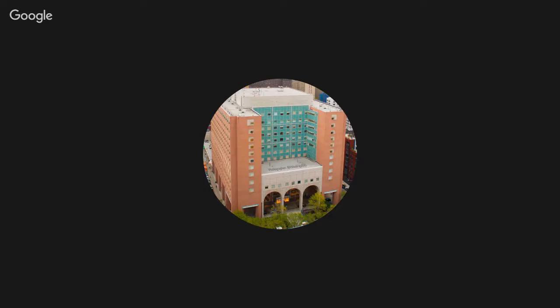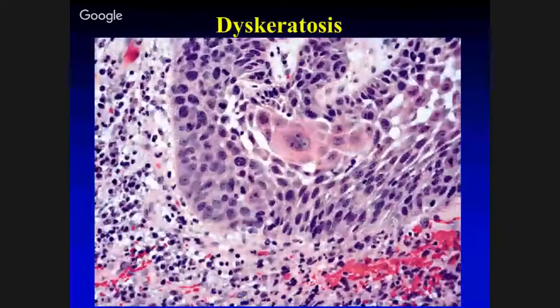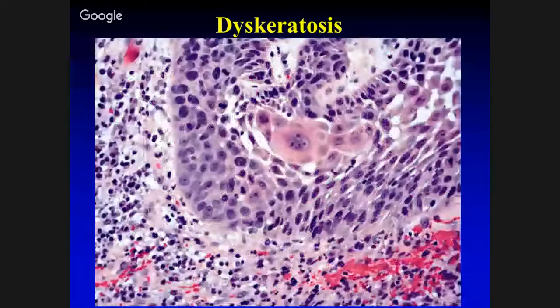This is one of several features that we use. It's like diagnostic nuclei for papillary thyroid carcinoma. To say grooves only, you're going to make a wrong diagnosis. If you just go by dyskeratosis without correlating cytologic changes that we see here, you'd be making a wrong diagnosis. You can get dyskeratosis as a reactive phenomenon.